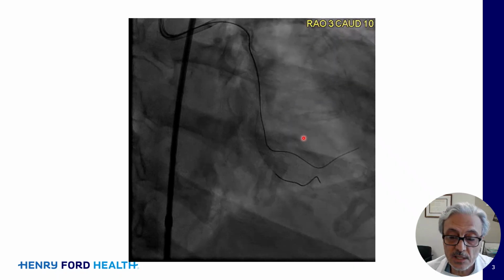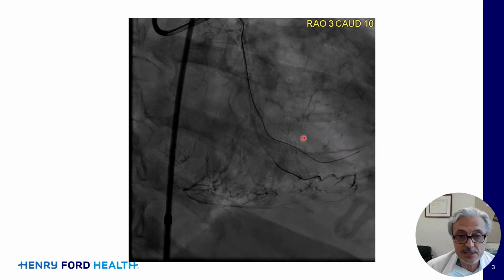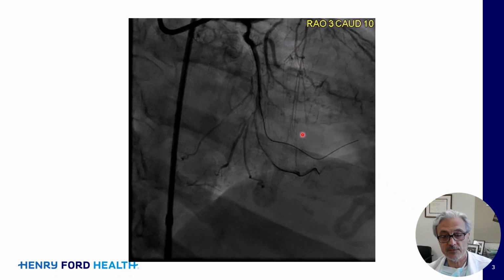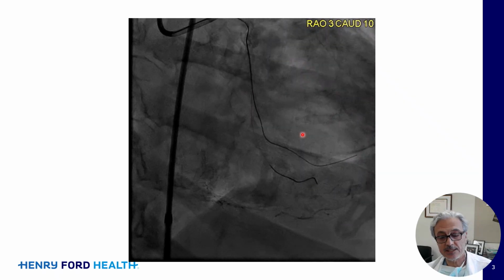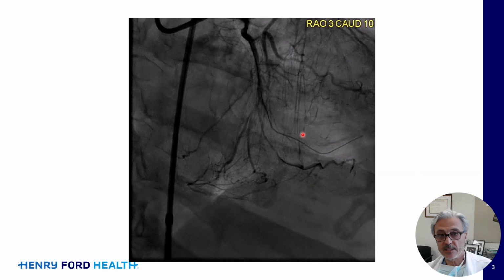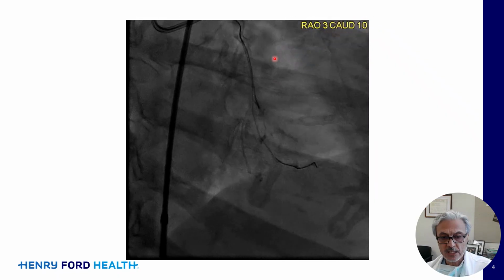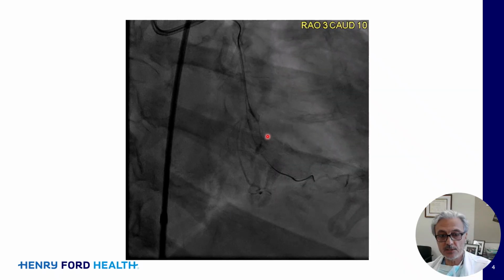In a patient with ischemic cardiomyopathy, you better not lose any side branches, because that's 10% of the myocardium if the side branch is 7.5 centimeters long, meaning 3 inches. If your patient has an EF of 30% and you lose 10% and 10% and 10%, you end up actually harming the patient. So if you notice here, we attempted to go into the second obtuse marginal.